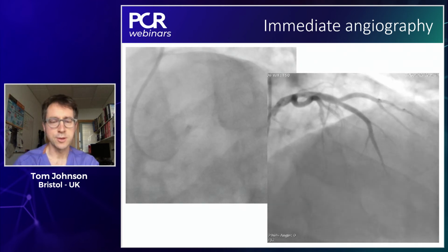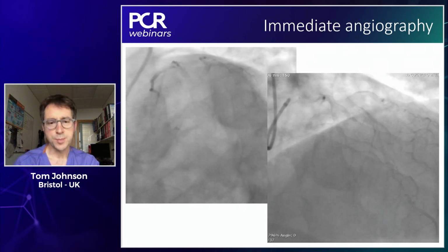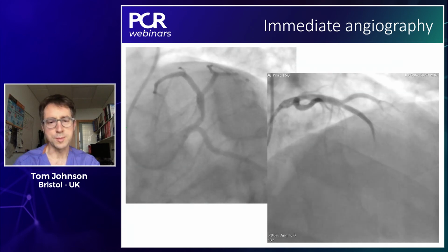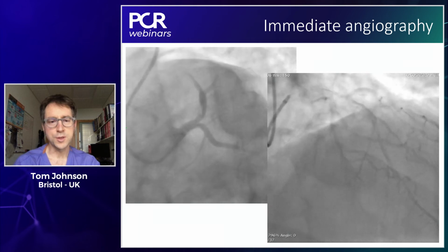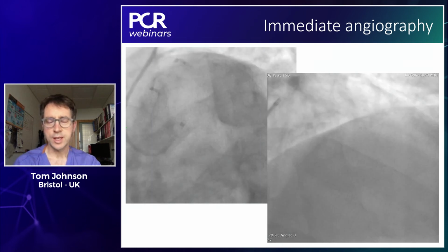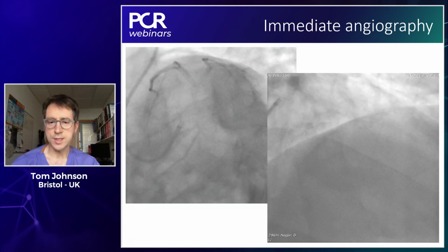And we see better in this spider projection a moderate lesion, really at best moderate, with some haziness in the ostium to proximal LAD. And again, this slightly sluggish TIMI 2 filling of the distal LAD.